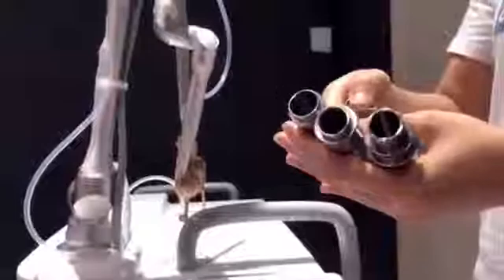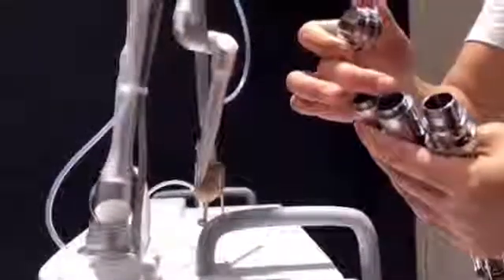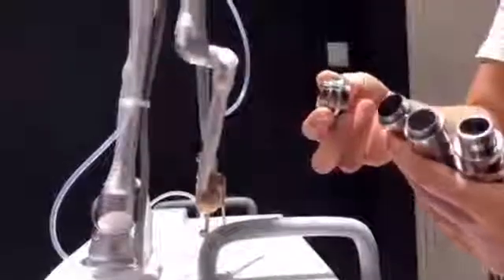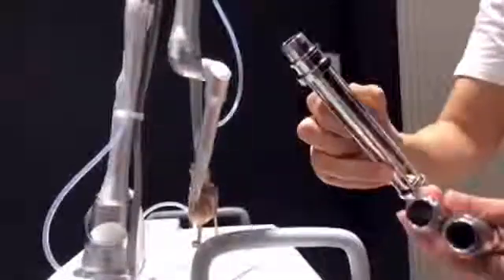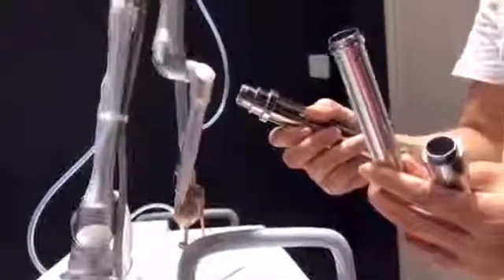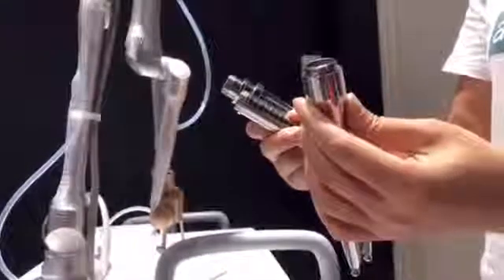For the vaginal treatment probes: there is one glass connector — each probe connected to the machine must connect with the glass first. This probe is for vagina tightening and rejuvenation. This probe is for cervical erosion treatment. And this one is for external vaginal aesthetics.